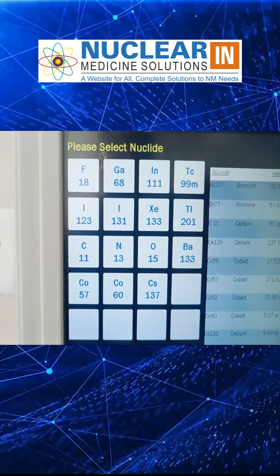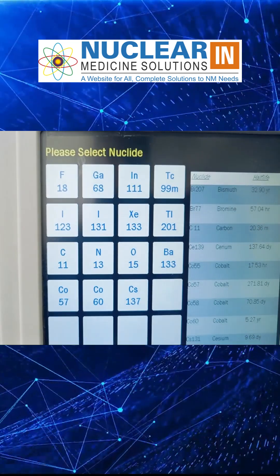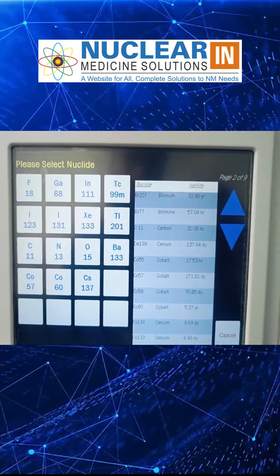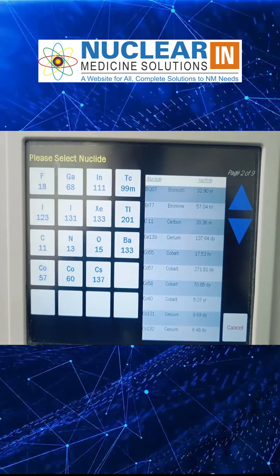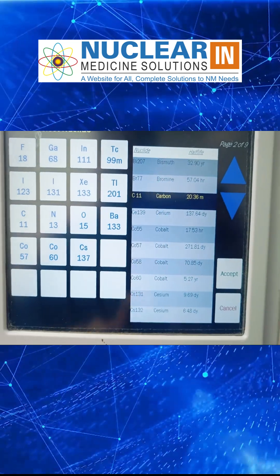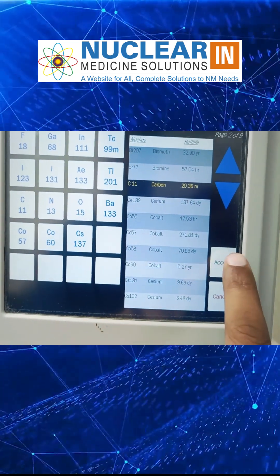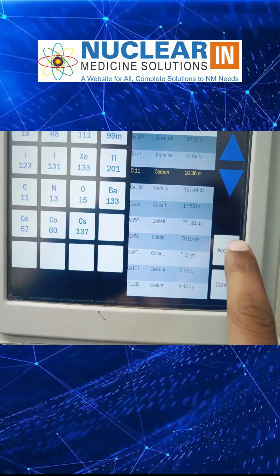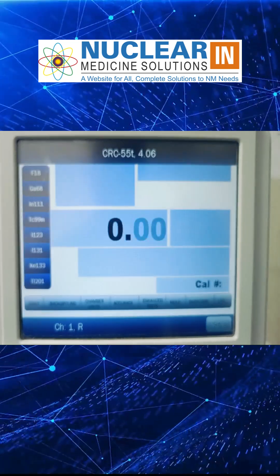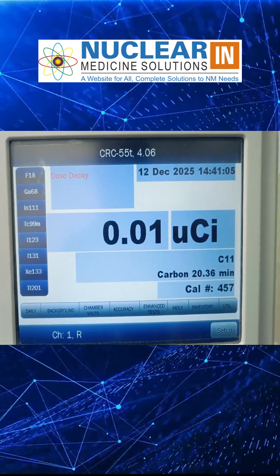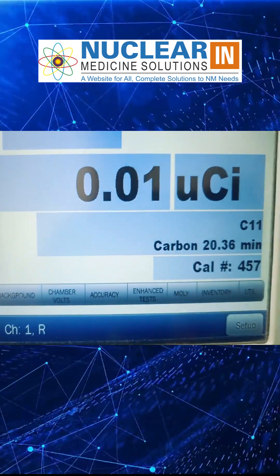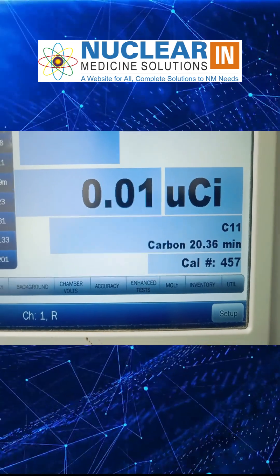Some more predefined isotopes are also given. Apart from that, if you want to choose some other isotope like C-11, you can simply click on it and select Accept, and it will open for C-11. The calibration factor has now been changed — it is 457.